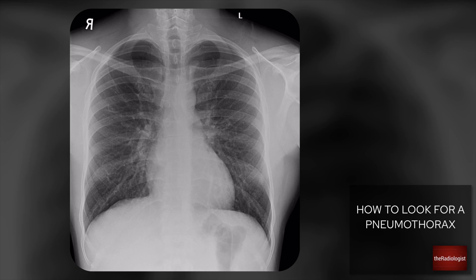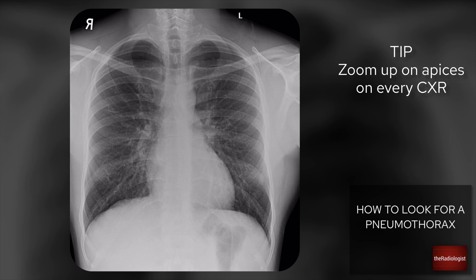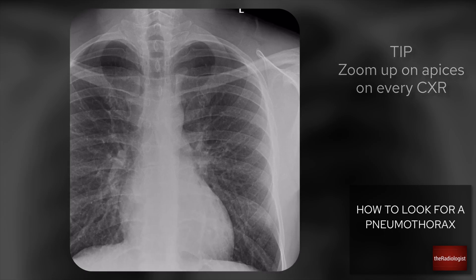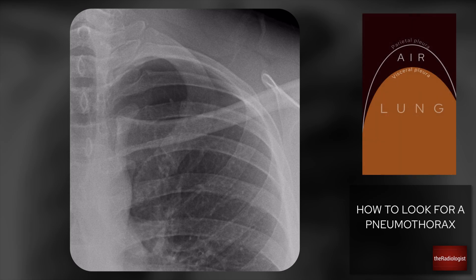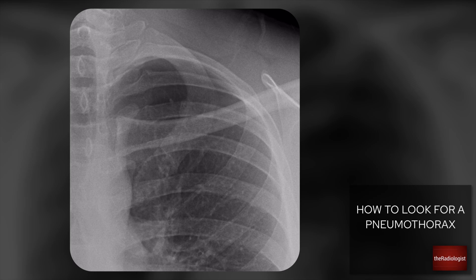Today we're going to look at how to identify a pneumothorax on a chest x-ray. The most important place to look is the lung apex — I don't consider a chest x-ray fully assessed until I've zoomed right up on the apices. In a pneumothorax, gas sits in the lining of the lung between the visceral and parietal pleuras, and when the patient is sitting or standing, that gas rises to the top of the lung.